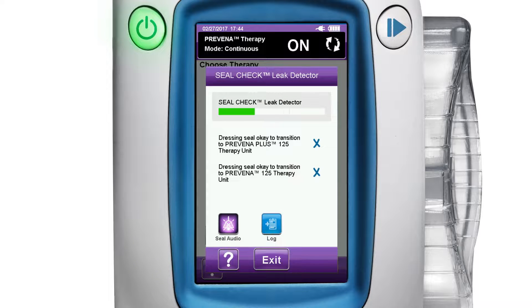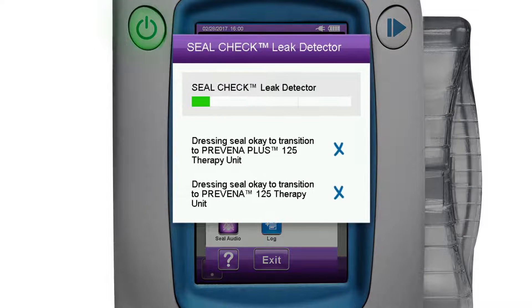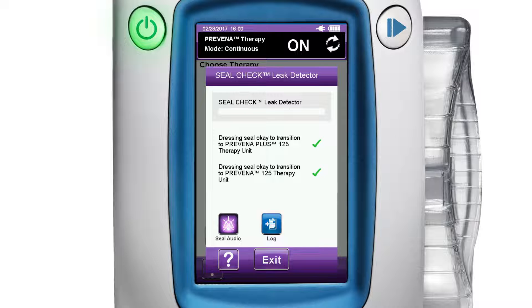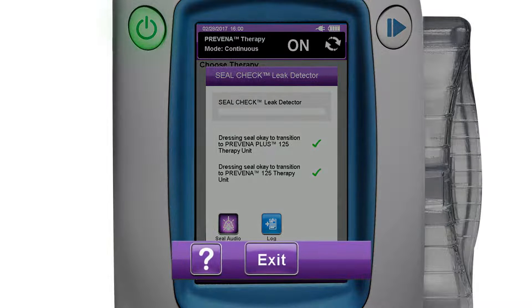Confirm seal check, then press the purple exit button if not transitioning to a Preavena therapy unit. The seal check screen assesses leak rates for subsequent transition to a portable disposable therapy unit such as 3M Preavena Plus 125 therapy unit or 3M Preavena 125 therapy unit. The seal check leak detector screen will display an X if the dressing seal is not adequate, or a check mark if the dressing seal is adequate for use with the associated Preavena therapy unit. Press the exit button to return to the home screen.